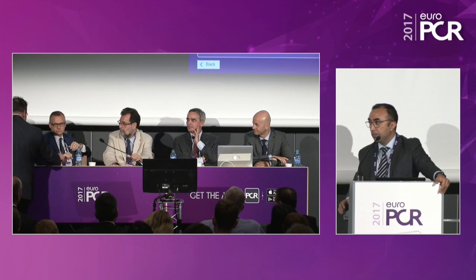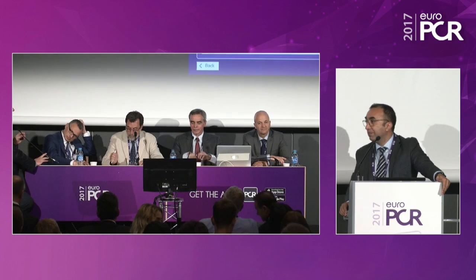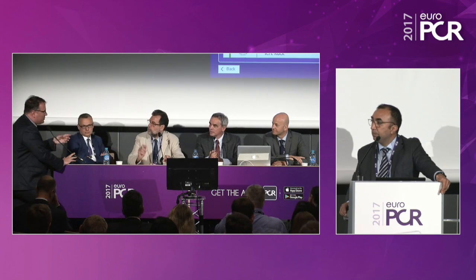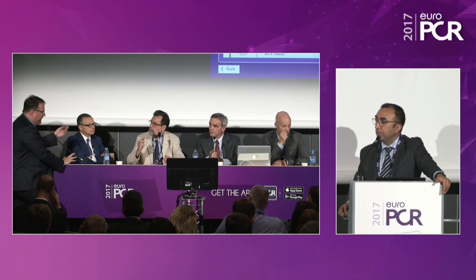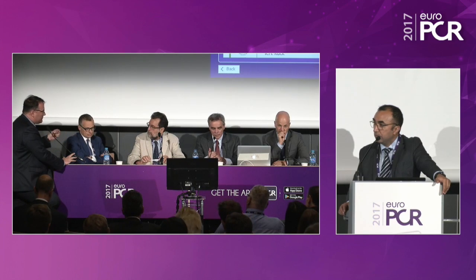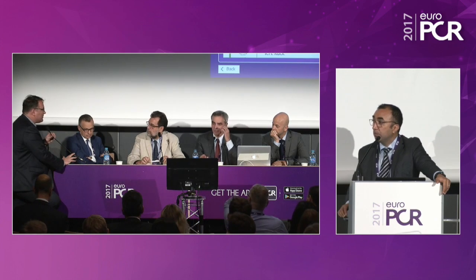So you stay, okay. I think it was all mentioned, but I would add to Asim that I think the ring is softer on the medial part to the septum. So one of the advantages that we haven't addressed yet is that we bring the same tension to the wire, but the tissue will react differently. So if you really look into the sequential fluoroscopies at cinching, you will see that the anchor distance decreases separately. And I think this is a huge advantage of such an implanted ring. We have the same distance in the beginning. We put the same pressure to all the distances between the anchors, but the softest region that dilates first will also be cinched first. So I think this is another idea why it may work in asymmetric tethering.